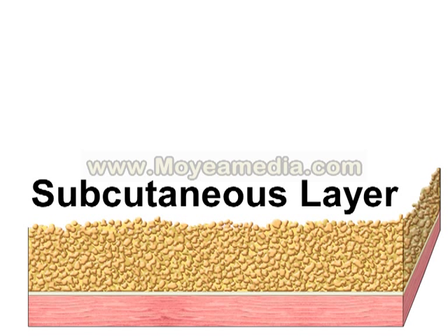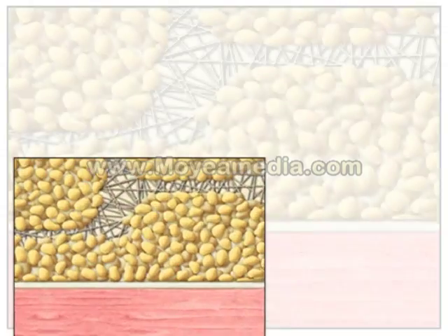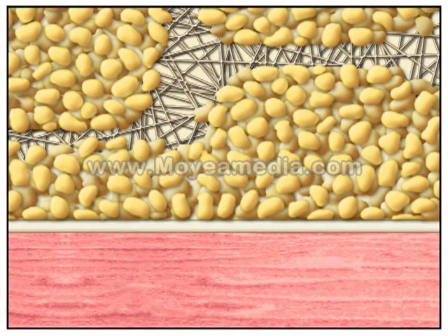Subcutaneous layer is composed of lipocytes divided by septi, with the blood vessels present within the septal structures. So higher power shows the septi in between the lobules of lipocytes.